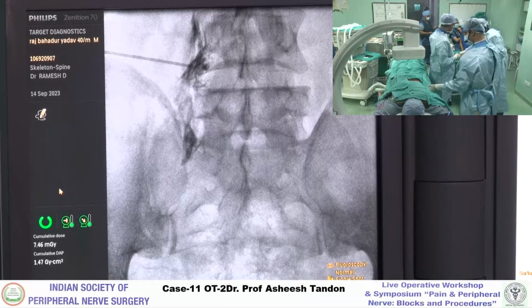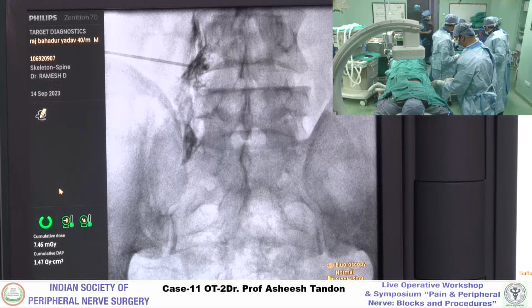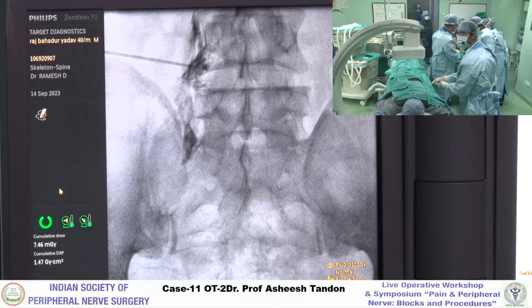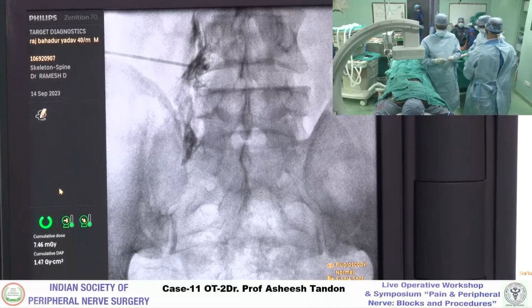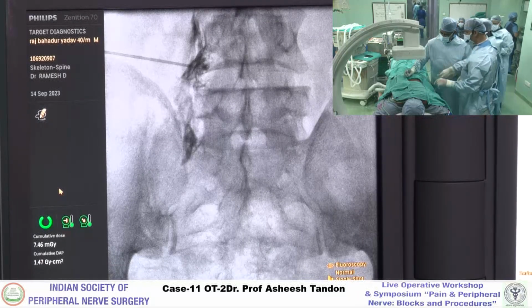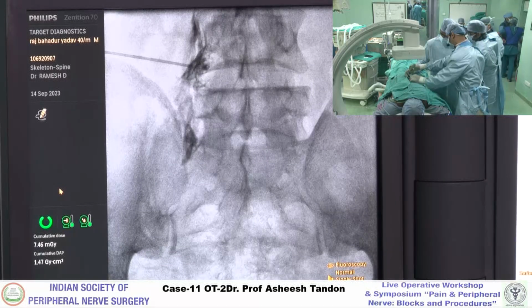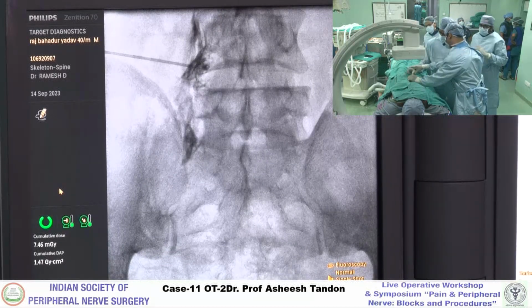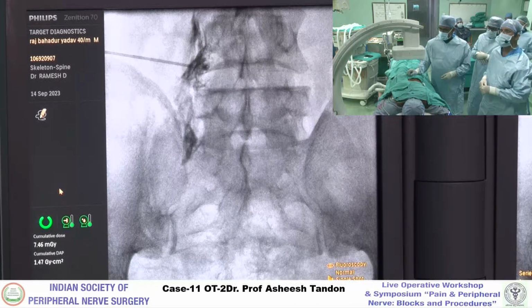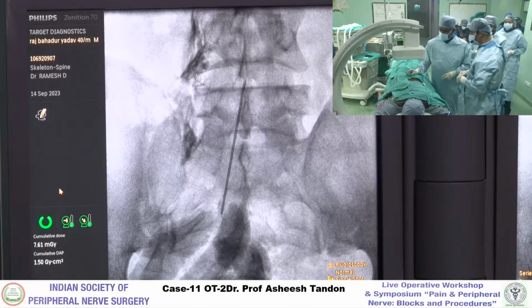Still it, please. The midline interlaminar, sorry. क्यों दिखा रहे हैं? राजेश मीना कर रहा है ना? हाँ, AP में वो देख लो, आपने लोकल लगाया हुआ है. वो तो क्या कर रहा है? So no, the best thing is you do it like this, so that radiation-wise your hand is safe. जितना. Shoot, please. हाँ तो 2 मिनट लगते हैं उसको करने में. क्यों? हाँ तो दुर्जय को बोलो करे. Okay, बस. Now you will need a feel.